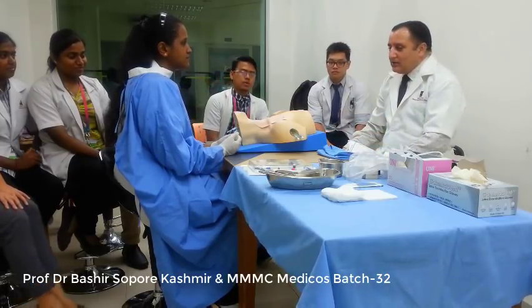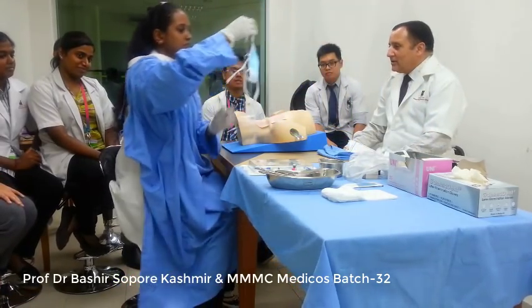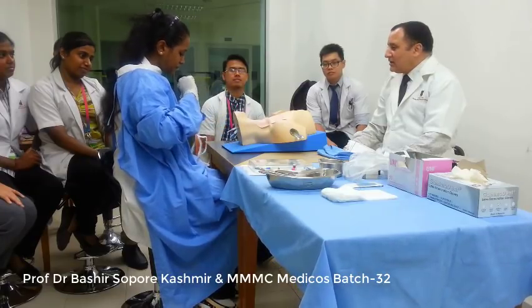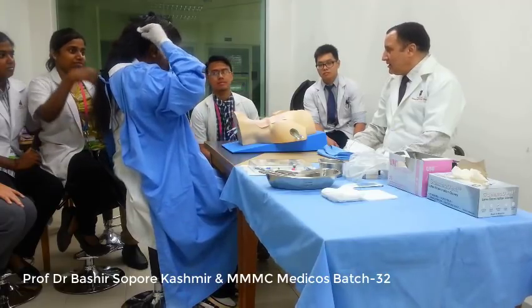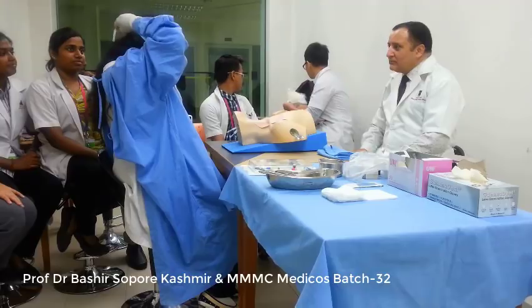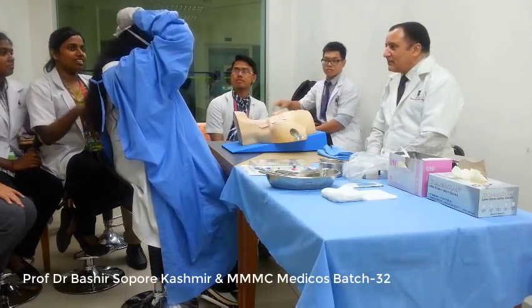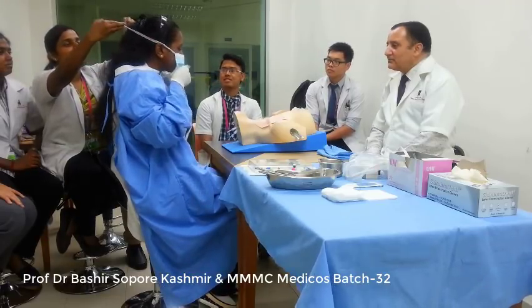So wearing the face mask, the cap to cover the hair, the sterile gown, and the gloves on, she is ready for performing the central venous catheterization.